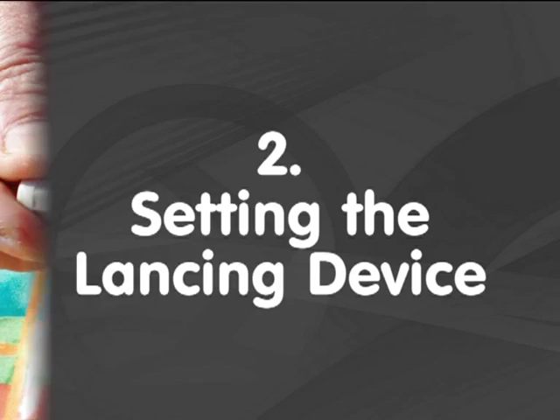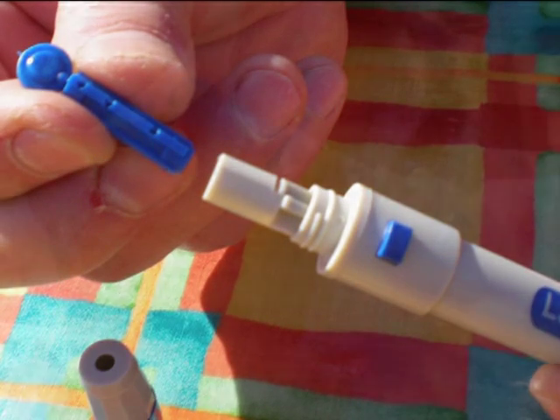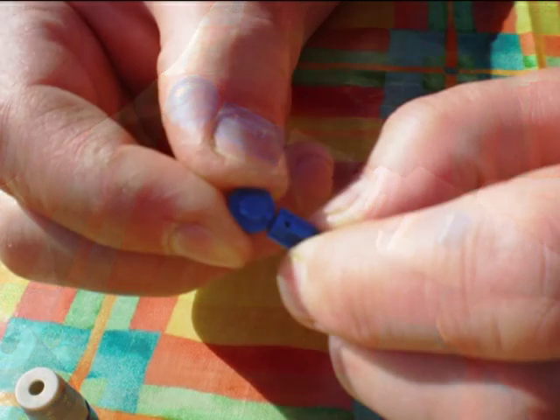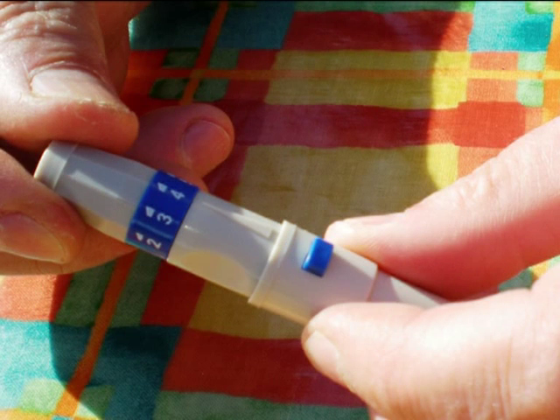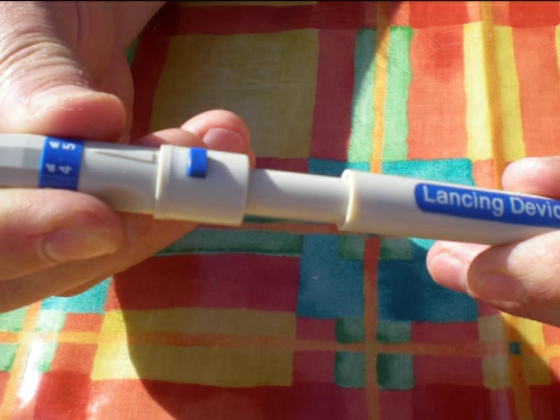Next you need to set the lancing device. This is very simple. First, unscrew the top cap and insert the blue lancing capsule by holding onto the top part of the lancing device and pushing until the capsule is fully engaged. Then hold onto the capsule and spin the protective cover at the top to remove it. Screw the top cap back on and then choose the depth of penetration you require. There are five settings. We have experienced that depth 5 gives the best results, however you should feel free to experiment and see what works best for you. Once you have chosen the depth, set the lancing device by pulling the bottom part and holding onto the top part until you hear a click and then releasing.